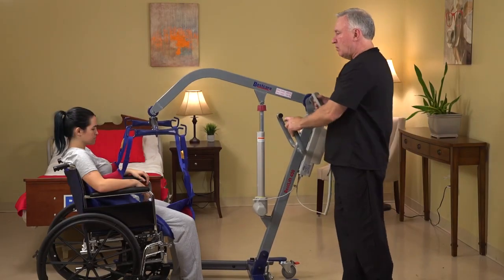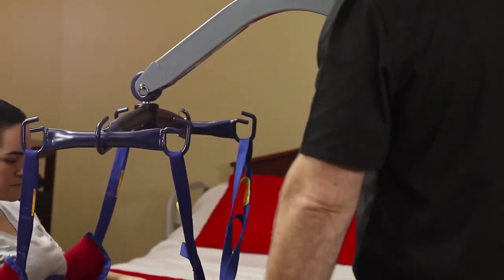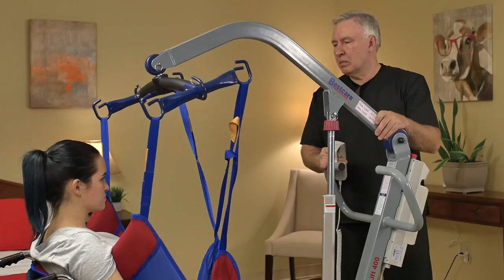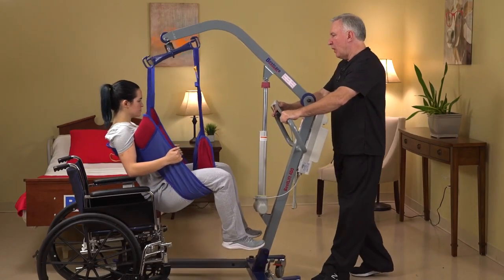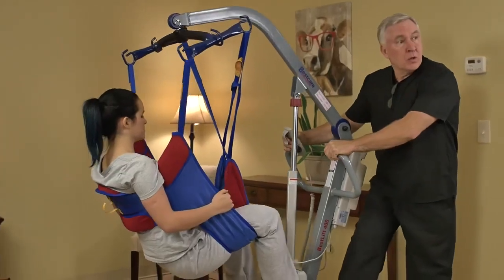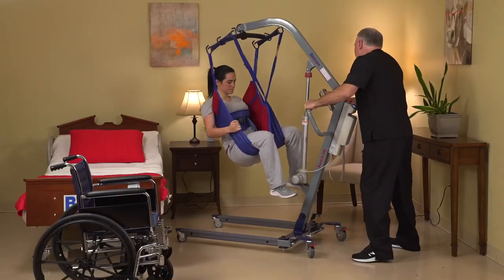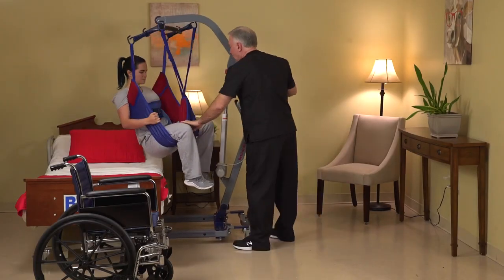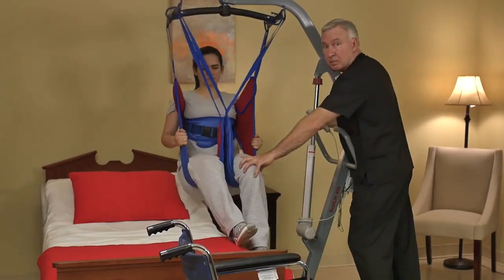Hit the up button, raise our patient out of the chair. Move the patient away from the wheelchair. Close the base on the lift. Take the patient over the bed, rotate the patient around, and now we can place the patient into the bed.